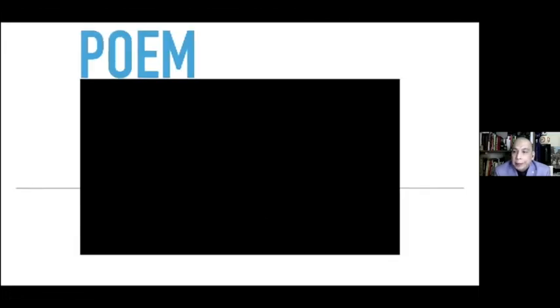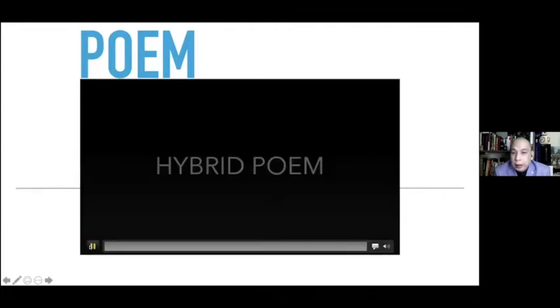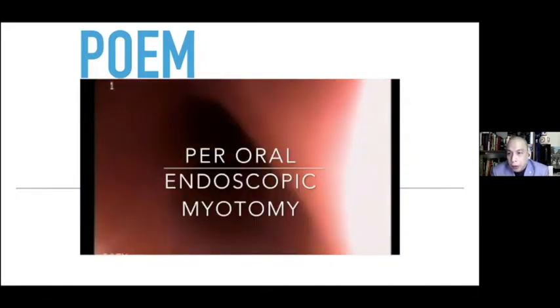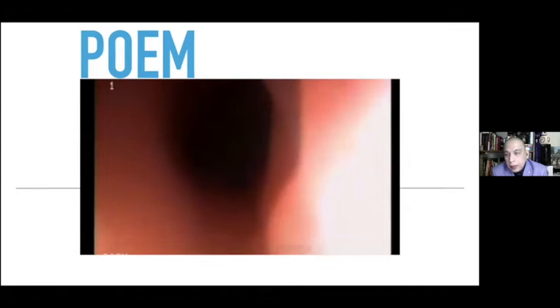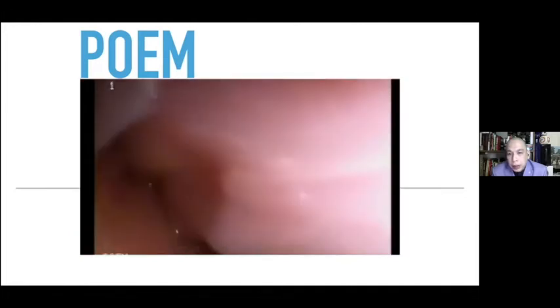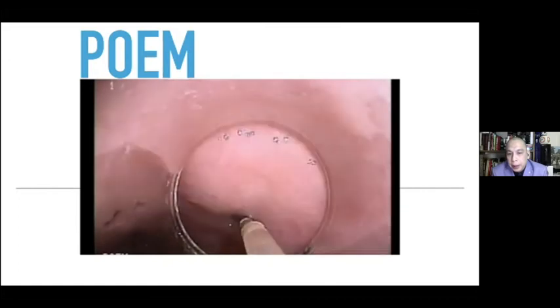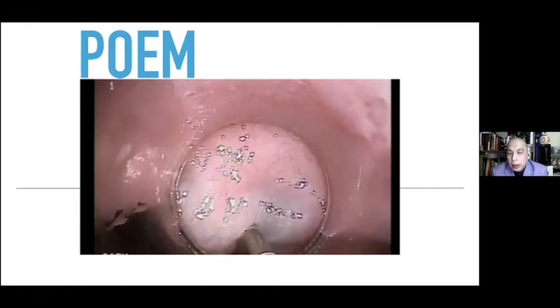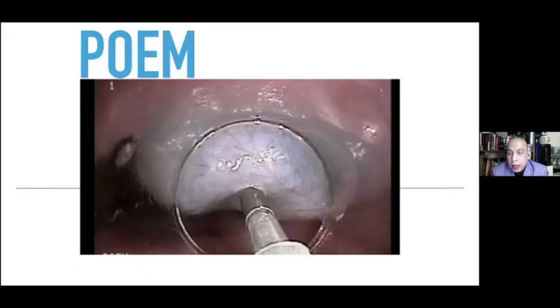And now Dr. Benefit showed you the laparoscopic way to treat patient with achalasia. Now we'll show you a combined method of doing endoscopic and laparoscopic treatment for achalasia. So we do the peroral endoscopic myotomy by doing submucosal tunneling. So we use a scope with a cap, a needle injecting a submucosal fluid cushion, to deassociate the mucosa away from the muscular area.